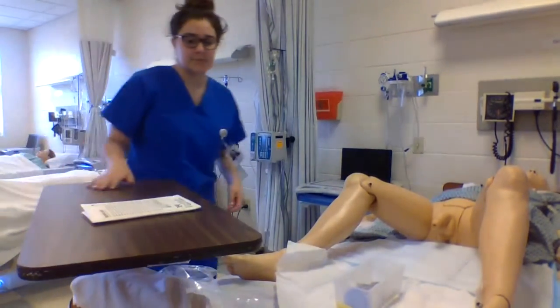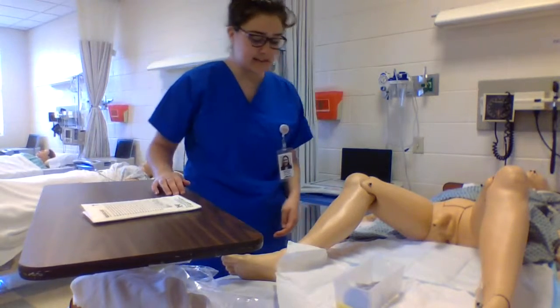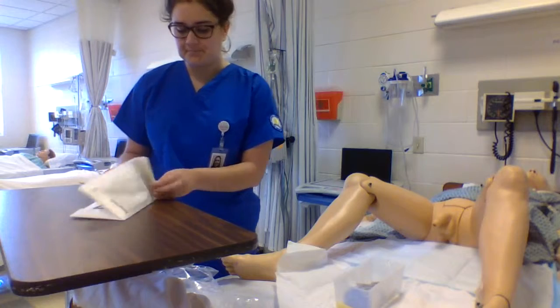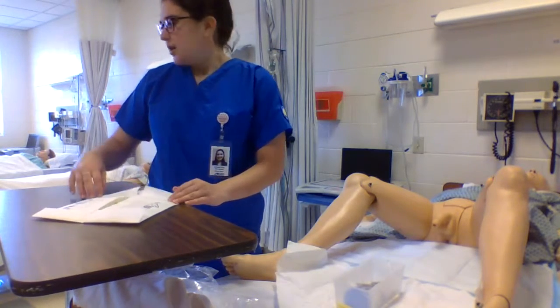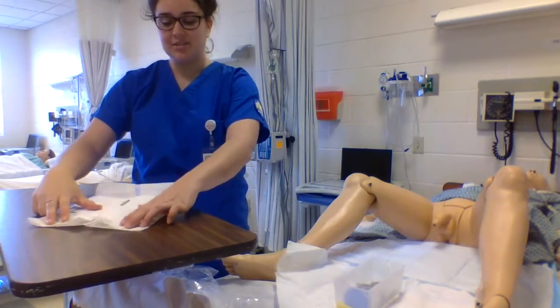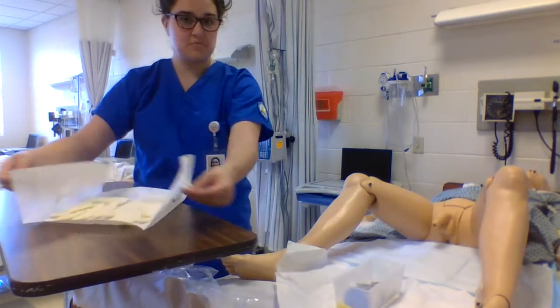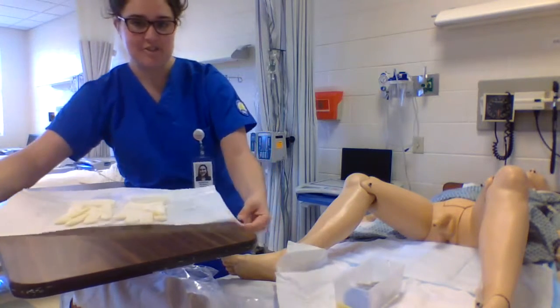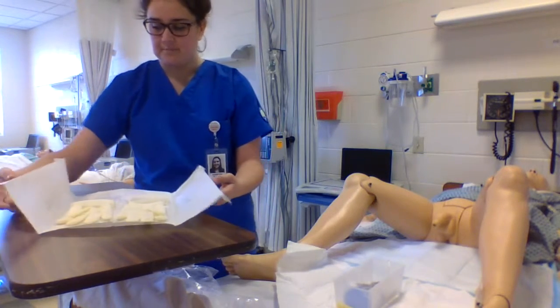All right. So now that I've got that in place, I'm going to go ahead and put on my sterile gloves. Sorry, I'm a little sick. In real practice, I probably wouldn't be giving him a catheter since I'm not feeling my best.